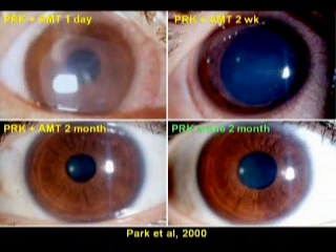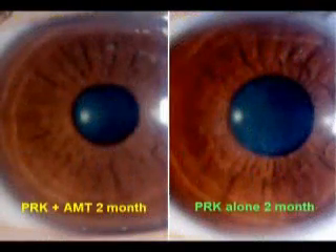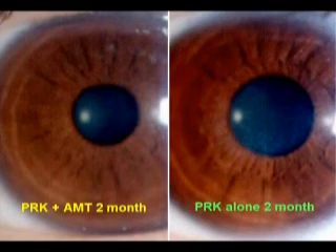This case is contributed by Dr. Park from Korea. He used amniotic membrane for refractive PRK in the right eye, showing recovery with minimum scar and haze. However, the fellow eye without amniotic membrane developed cornea haze. This high magnification illustrates the difference: the right eye with amniotic membrane shows clear recovery, while the left eye without amniotic membrane shows a superficial haze two months later.